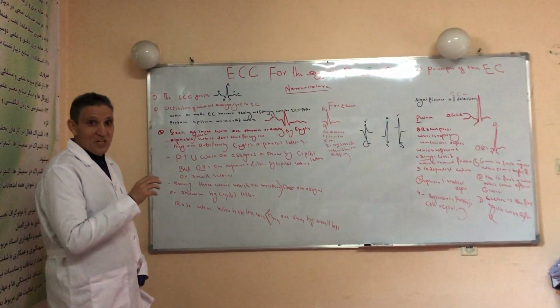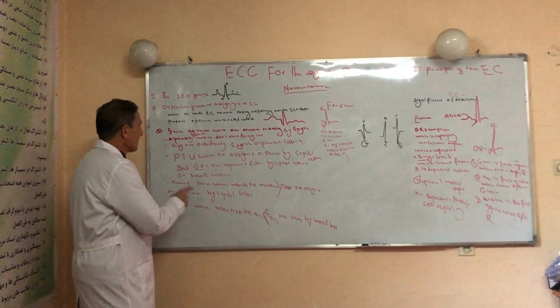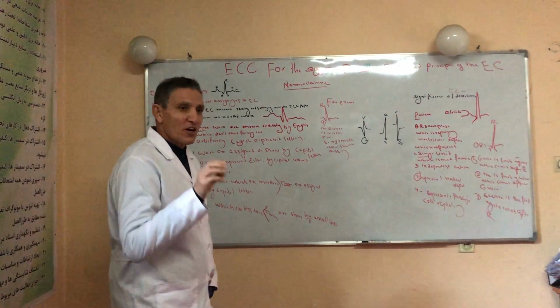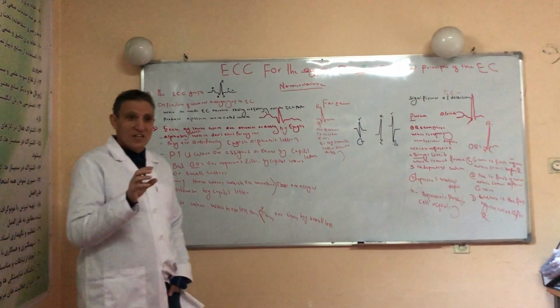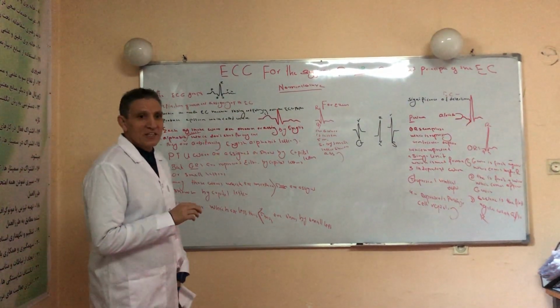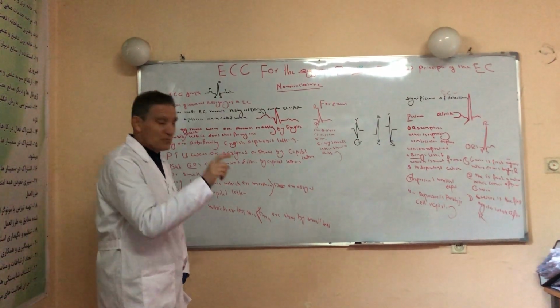It is a little bit tough to know the mechanism by which the QRS complex is produced and assigned. Each of these waves is shown by an English alphabet letter, which doesn't stand for anything; they are arbitrary. Remember, the P, T, and U waves are always represented by capital letters. The QRS complex can be represented by either capital or small letters.